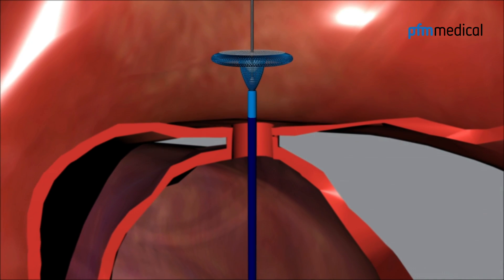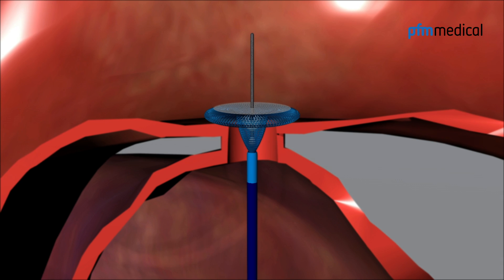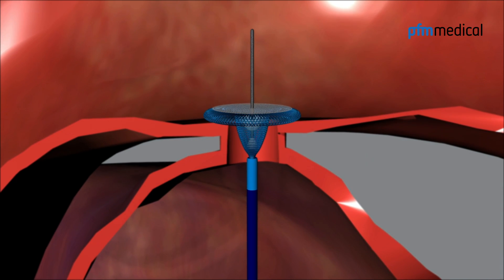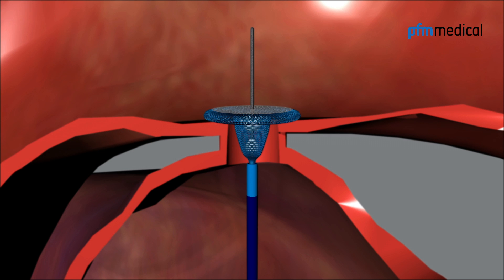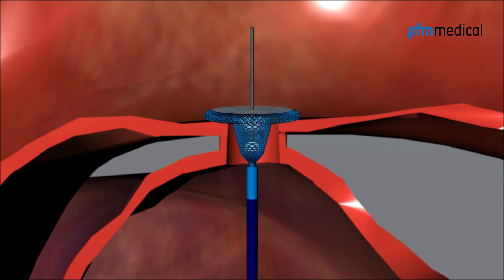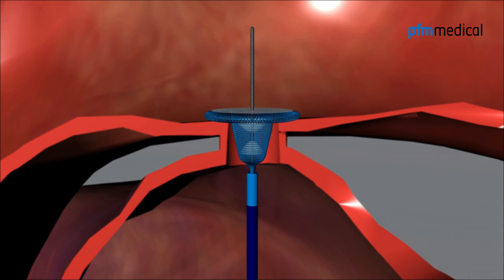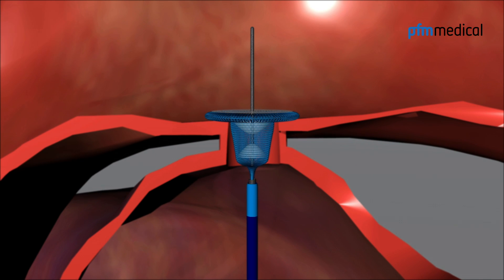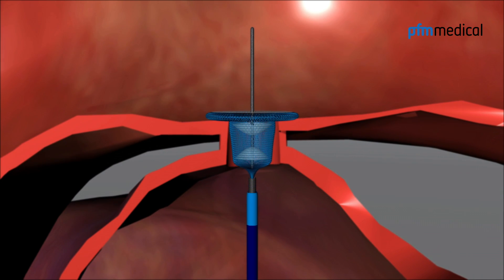The entire system is retracted until the occluder is carefully positioned inside the ductus. Now the stent part expands fully inside the ductus.